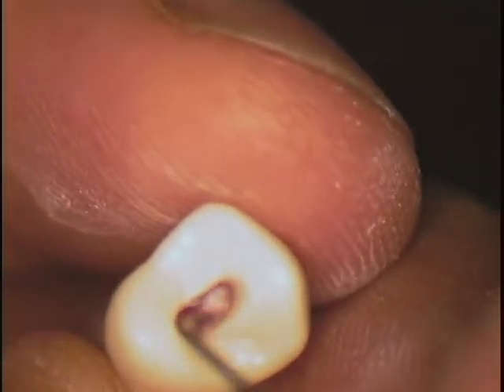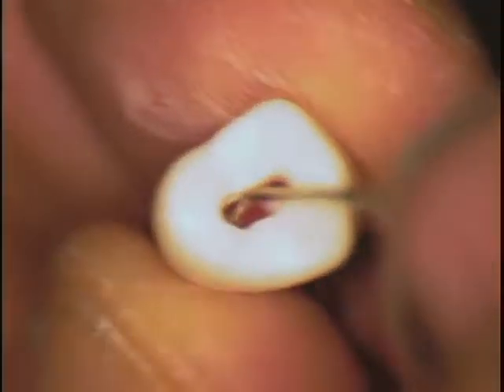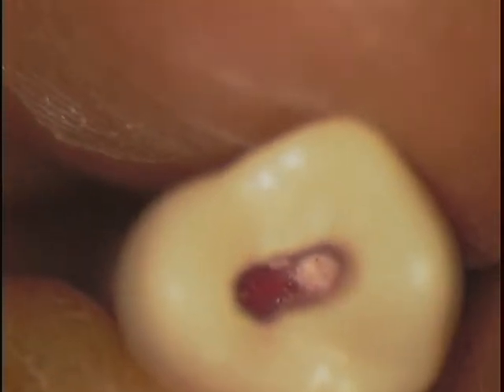Now, the next step is once you're in there, you have to feel for ledges. So you take your Explorer again, and you start just feeling now for the horns and the ledges. I'm going to feel for all those. So I've got a few here. I got one there. I got one there. So let's do this. I'm going to just increase the size of this. There. And there we go. Okay.